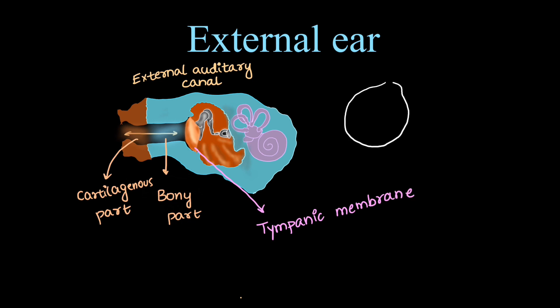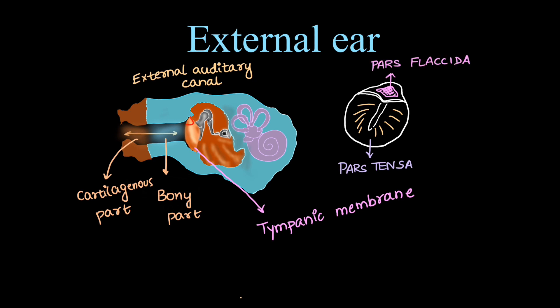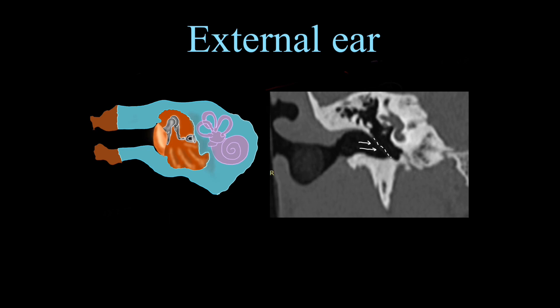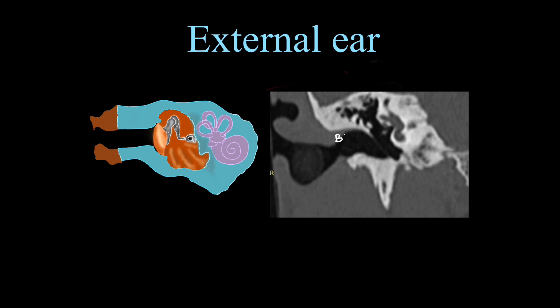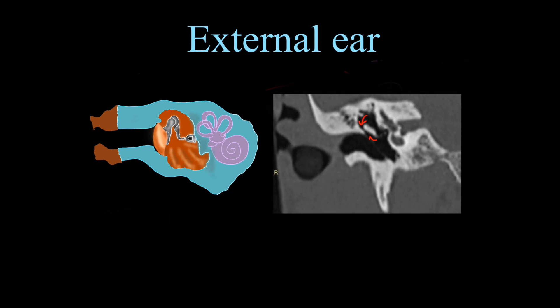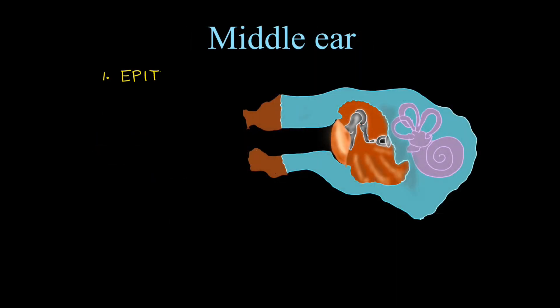Next we have the tympanic membrane, which has two parts. The lower major portion is the pars tensa and the small portion above is called pars flaccida. On CT, the tympanic membrane is best seen on coronal sections. The attachment of pars flaccida to the bony part is the scutum, which is eroded in cholesteatoma or CSOM. The small space in the epitympanum between the scutum and the malleus is called the Prussak's space, which is the starting point for cholesteatoma.